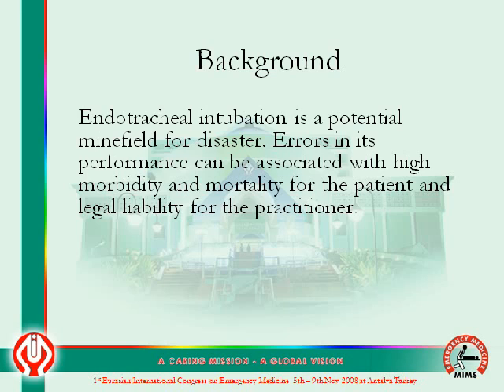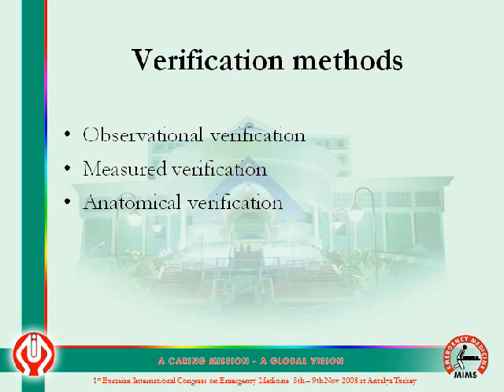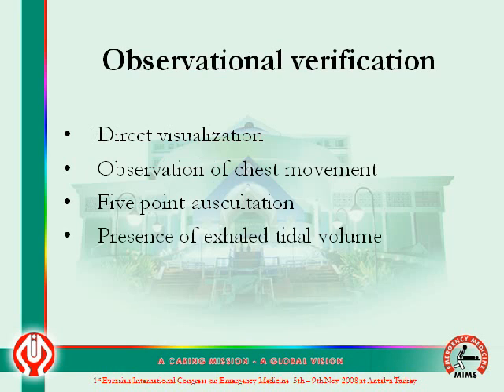Endotracheal intubation is a potential minefield for disaster. Errors in its performance can be associated with high morbidity and mortality for the patient and legal liability for the practitioner. Currently, there are many methods available, which can be classified under three headings: observational verification methods, measured verification methods, and anatomical verification methods.